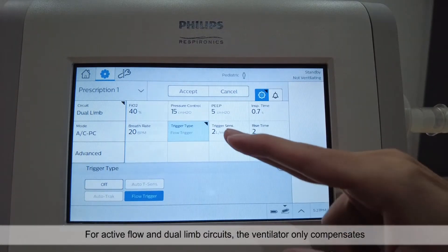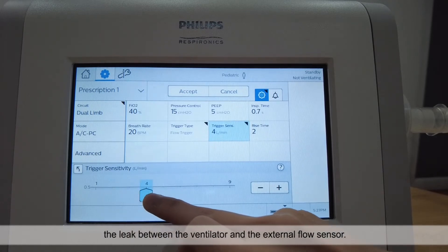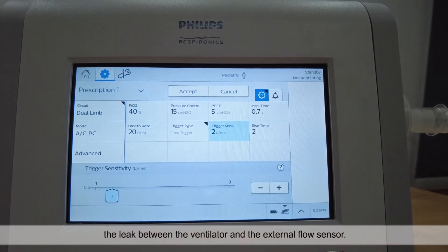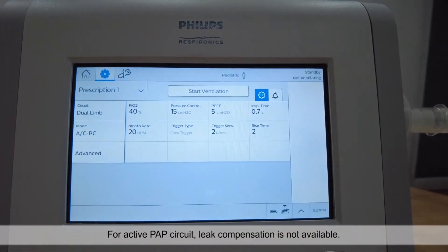For active flow and dual limb circuits, the ventilator only compensates the leak between the ventilator and the external flow sensor. For active PAP circuit, leak compensation is not available.